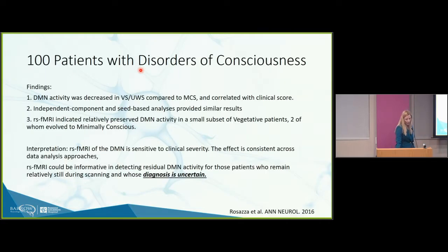This is an Italian study looking at 100 patients with disorders of consciousness, and they essentially found the same thing, that the default mode network differentiated between those who regained consciousness and did not. And they used the same analytic techniques that we use here. And they recommended using this test in those in which diagnosis is uncertain at the bedside, which in my mind is pretty much everybody who's in a coma or has a serious disorder of consciousness, because guessing isn't that great of a tool.